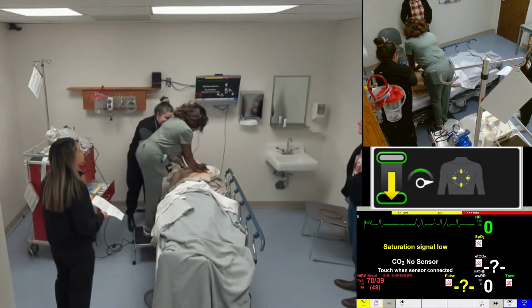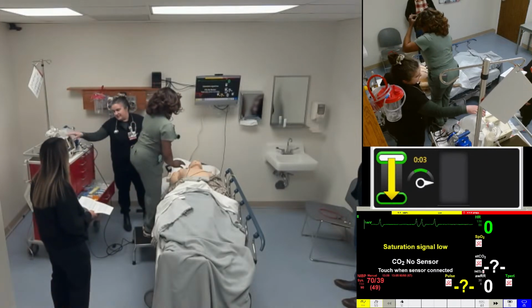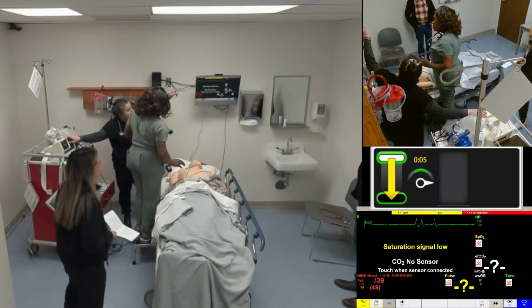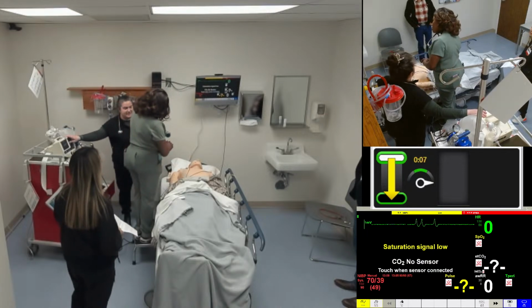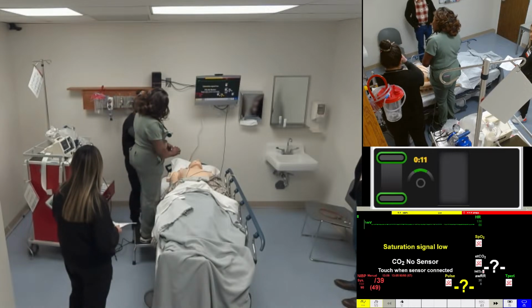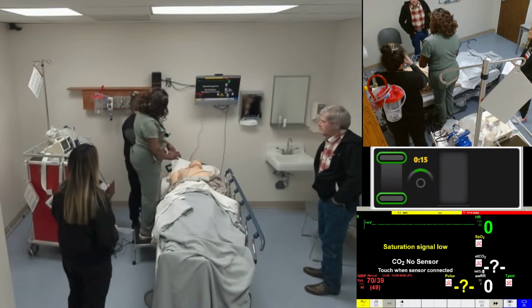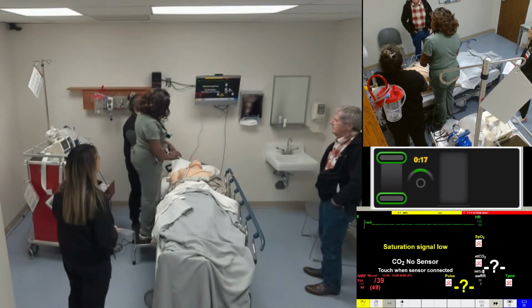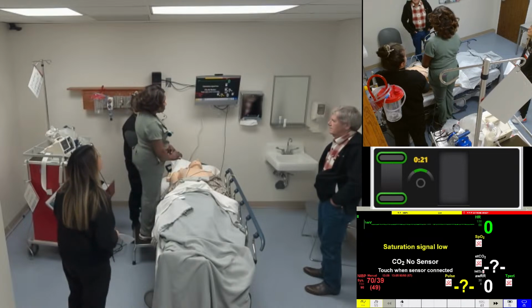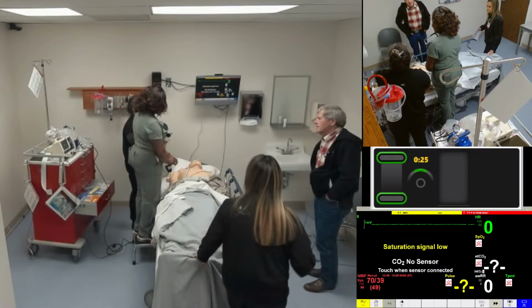All right, Dr. Ruba, you have been coding this patient for 1 hour. Would you like to do one last rhythm analysis? Yes, please. And it's still asystole to me. All right. Do you want to call it, or is there anything else you would like to do for this patient? Is family around? No. Push analyze. That's it. We're gonna call it.